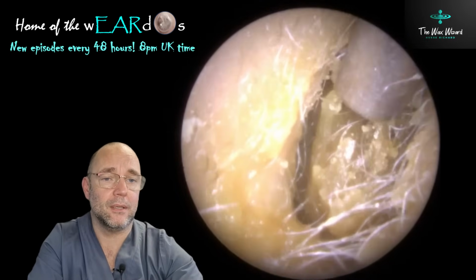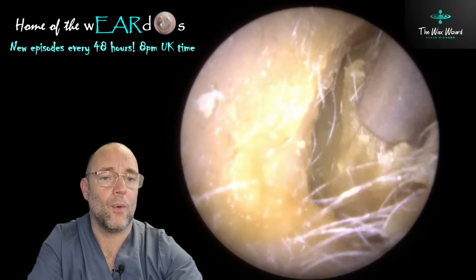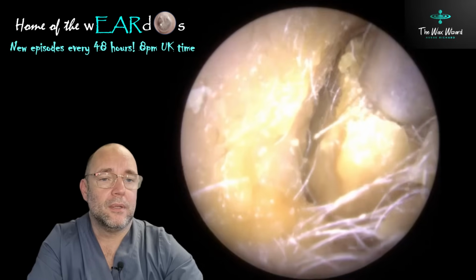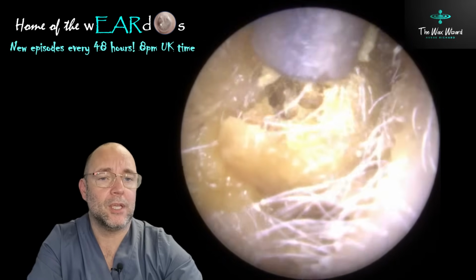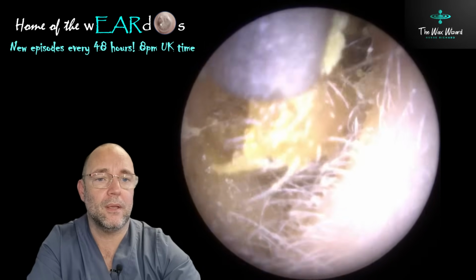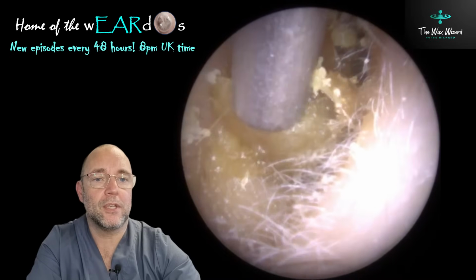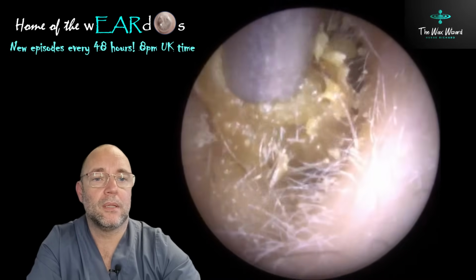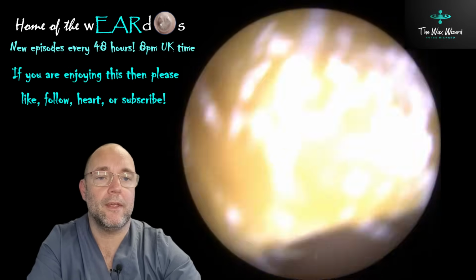So this is the home visit. Quite dry. This one wasn't quite as hairy as the other one. But quite a narrow little ear. This, if I remember right, I think her husband was helping to prop it open because it was really difficult to get inside. It was a fair old distance away from me as well, this one. But like I said, don't mind travelling about here, there and everywhere.